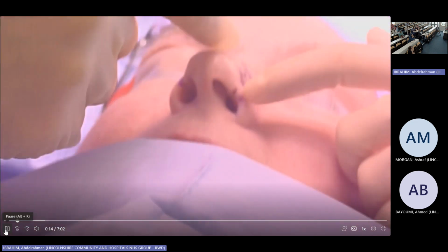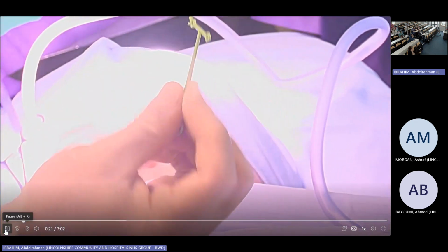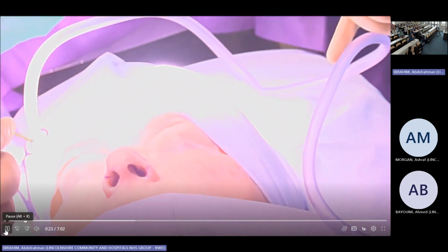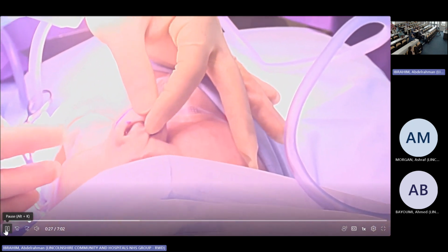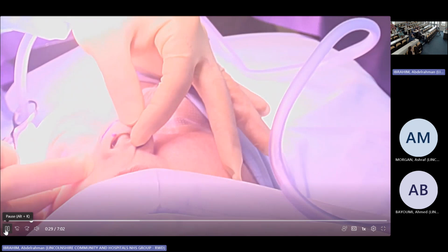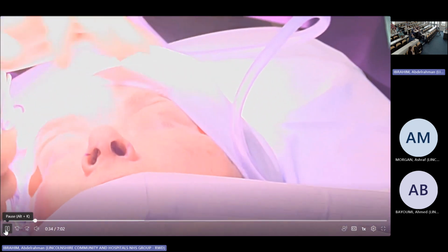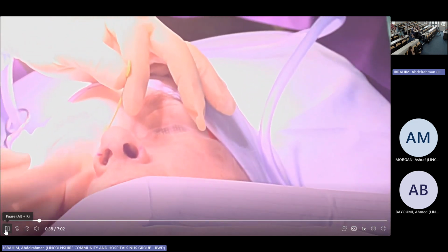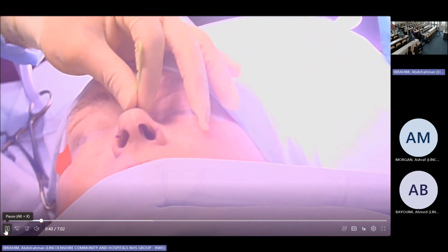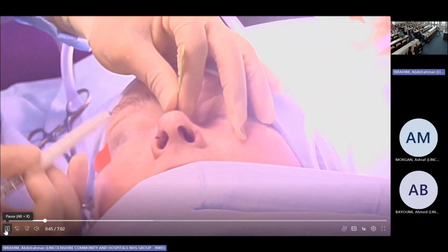I might leave the video to run through. So already I've done the marker, so sorry for this, but I will show you laterally how we mark it as well. So this is actually like a demo of the implant. So you know the direction of the implantation, and at the same time you can put the points for your marking, which are the top and the end of it.